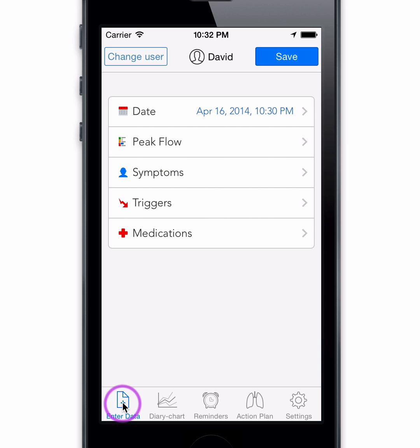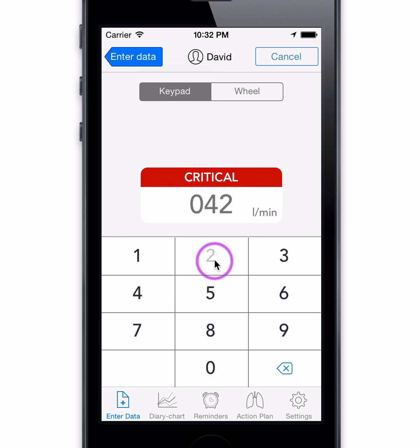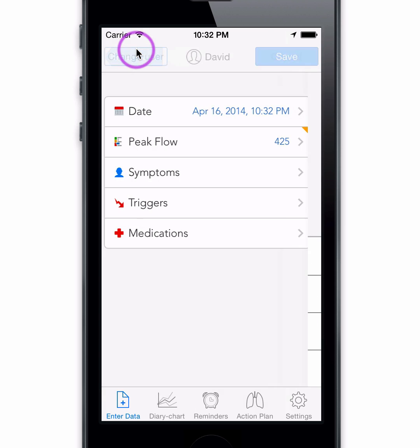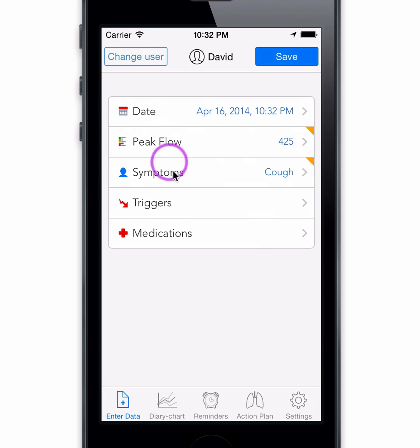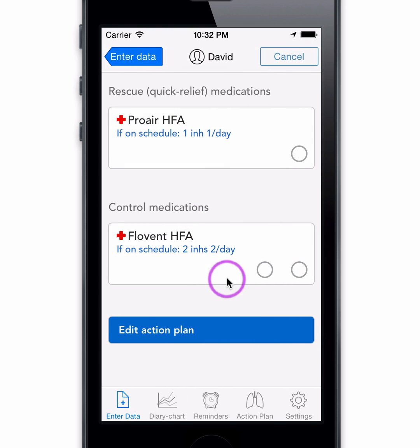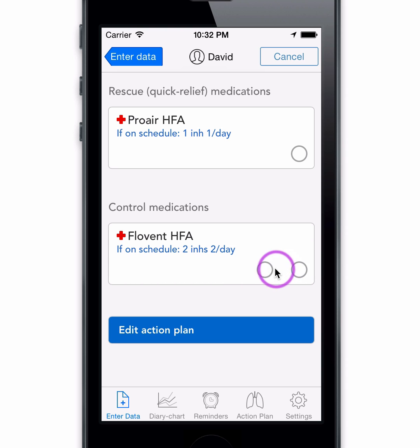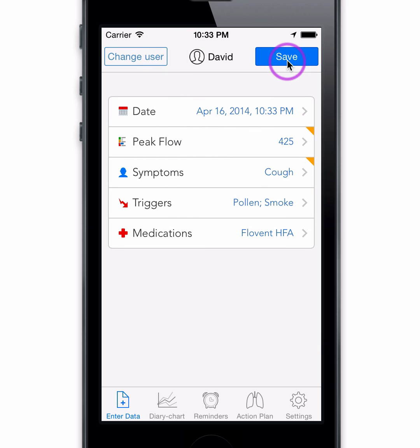Now you can enter your peak flow measurement, symptoms, triggers, and pick your medication. When checking medications, each bubble represents one dose based on your medication daily frequency. In this case, there are two bubbles representing two doses per day. Our integrated medication entry is connected to both reminder and adherence functionalities.